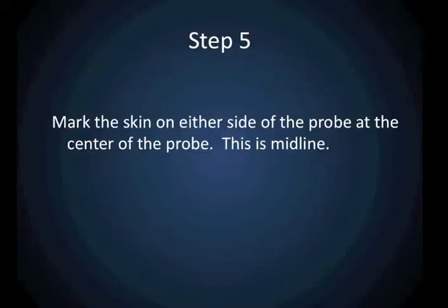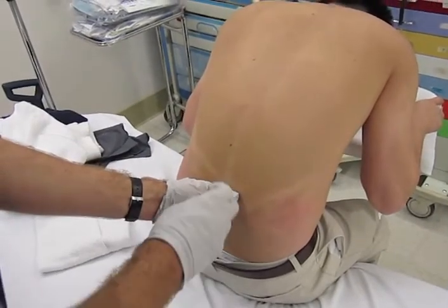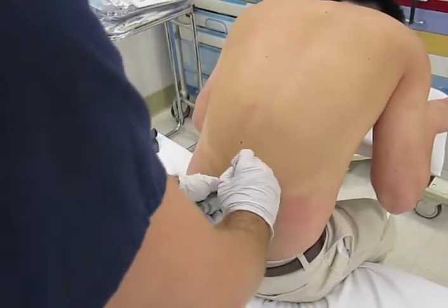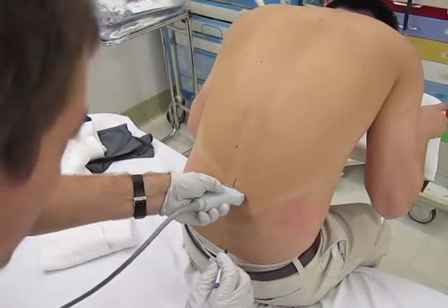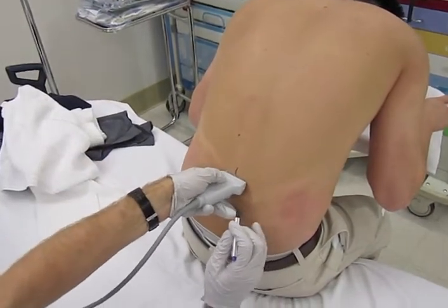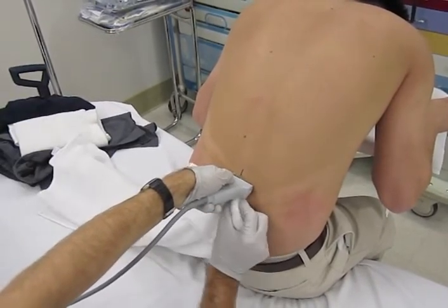Once you have found the spinous process and centered it in the middle of the ultrasound screen, you are going to make two skin marks on the patient's back. Place these marks right in the middle of the probe on either side. When the probe is removed from the patient's back, these two marks tell you where midline is.